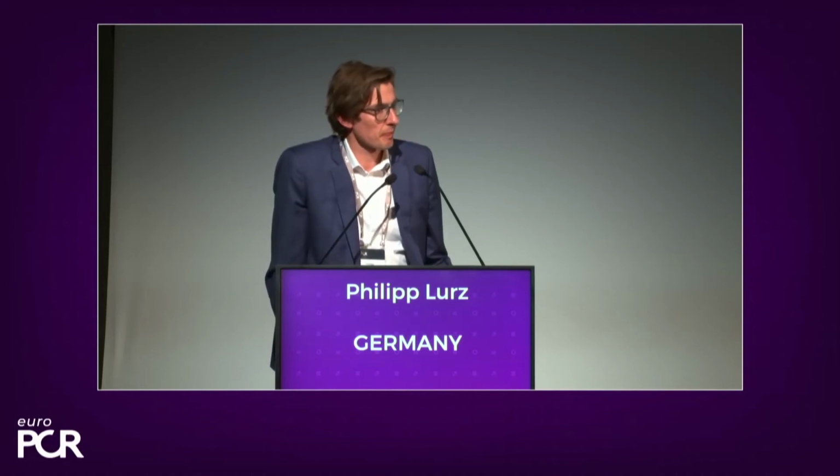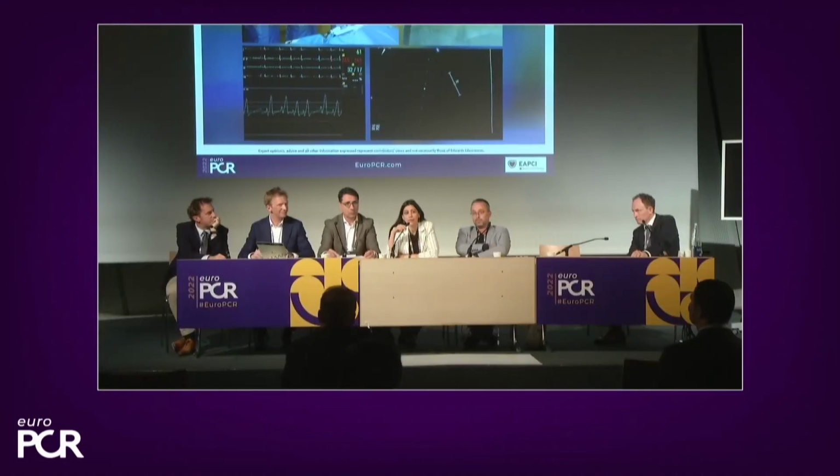Very nice case and very impressive results. We have some time for comments or questions from the audience. If you have any, don't hesitate.